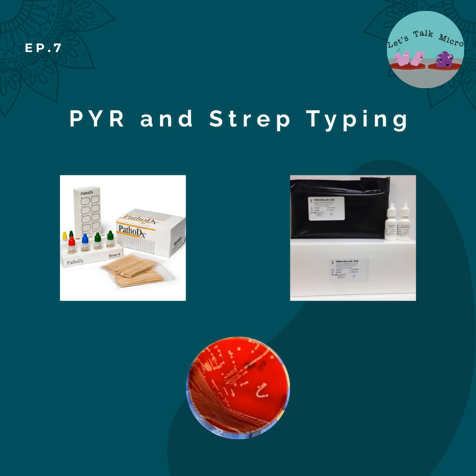Now, if you're doing clusters, because that's also in the flow chart, catalase negative gram-positive cocci in clusters, you do a PYR. If it's positive, you probably have Aerococcus viridans. If it's negative, you have Aerococcus urinae probably. And then with your chains, PYR negative, alpha or gamma hemolytic, you can have either anginosus or Strep viridans. So it's a very good flow chart. So go ahead and take the time, the pictures are on Instagram. Go ahead and take advantage of it. There's some really good information in there.